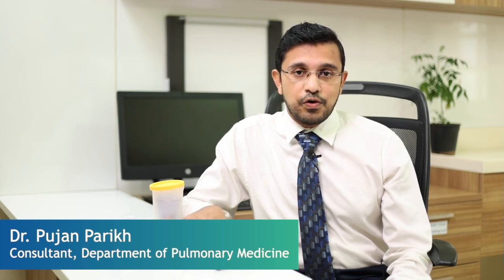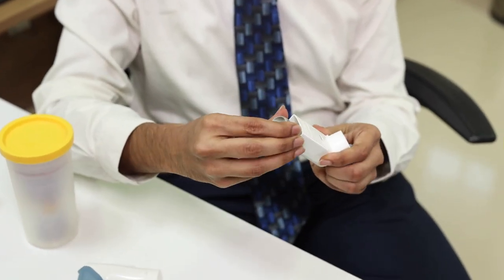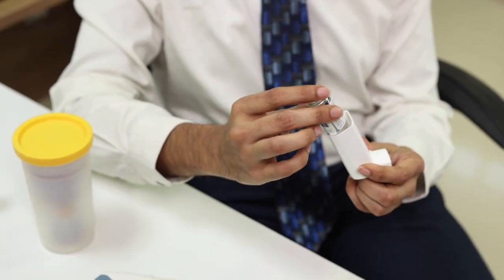I'll first talk about MDI. MDI is a metered dose inhaler. So this is what we call an MDI. It has a canister. This is the canister which contains the medicine.